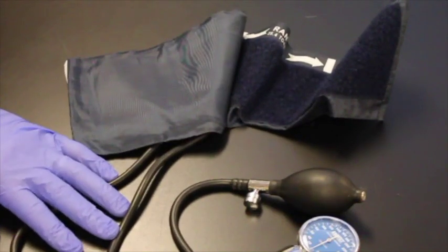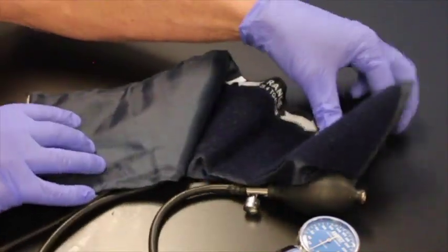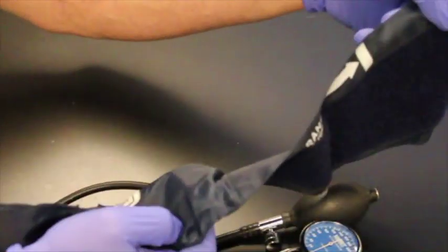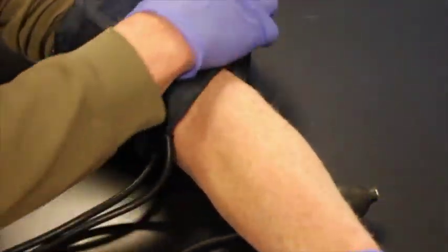Okay, so I'm going to give you an example of how to use this sphygmomanometer to measure your blood pressure. So I'll start by putting this on my arm.